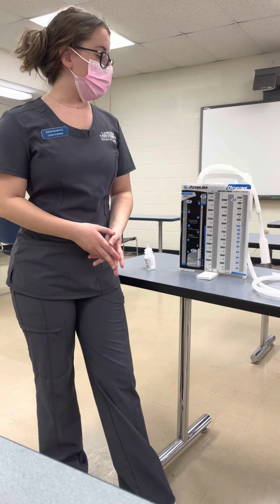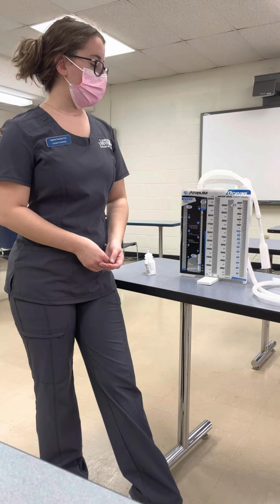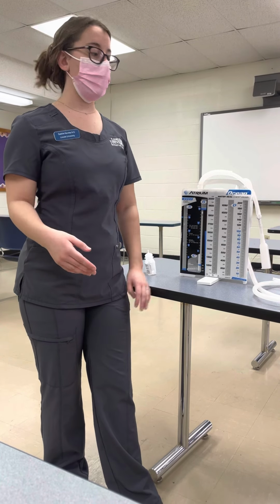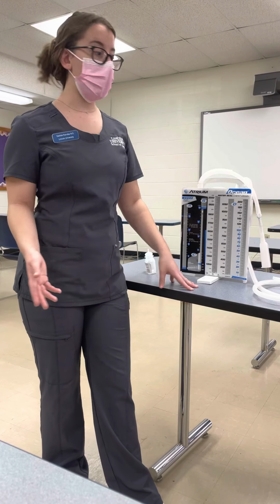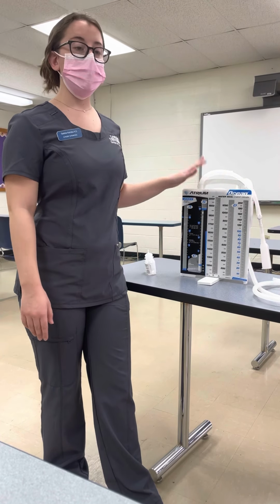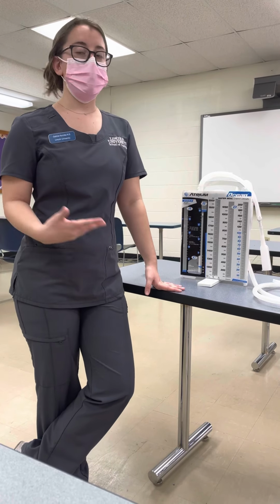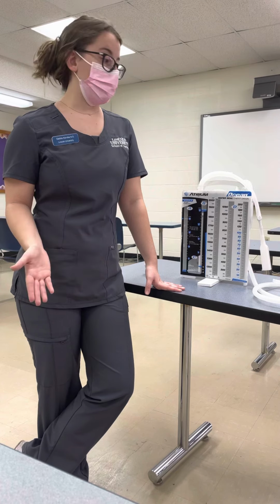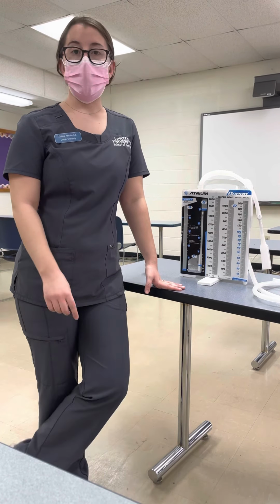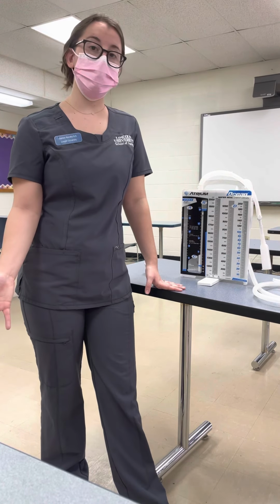The next thing we'll do is also explain and do some patient teaching. We want to teach our patient that they need to use their call light as much as possible because we don't want either of these tubes to come dislodged. We don't want the chambers, the system here to fall over. So they really need to use their call light if they need to get up, repositioned, go to the bathroom, anything like that. We also need to let them know to report if they're having shortness of breath or pain at any time, and we can address those things.